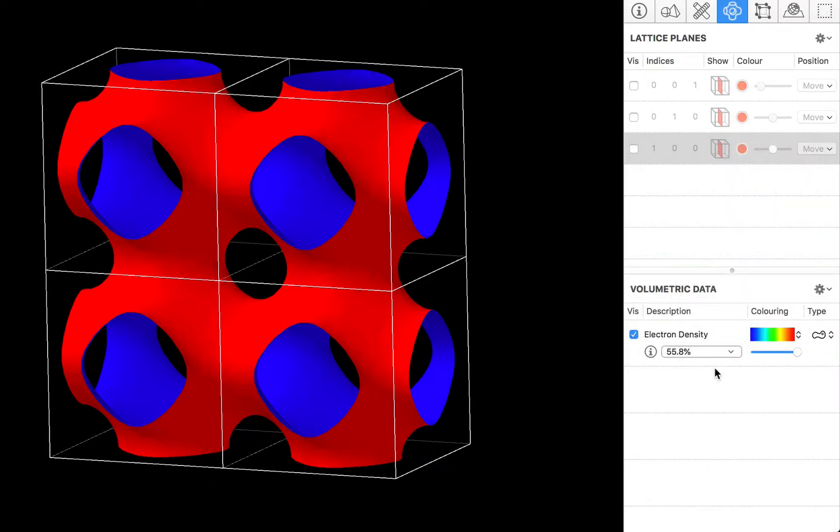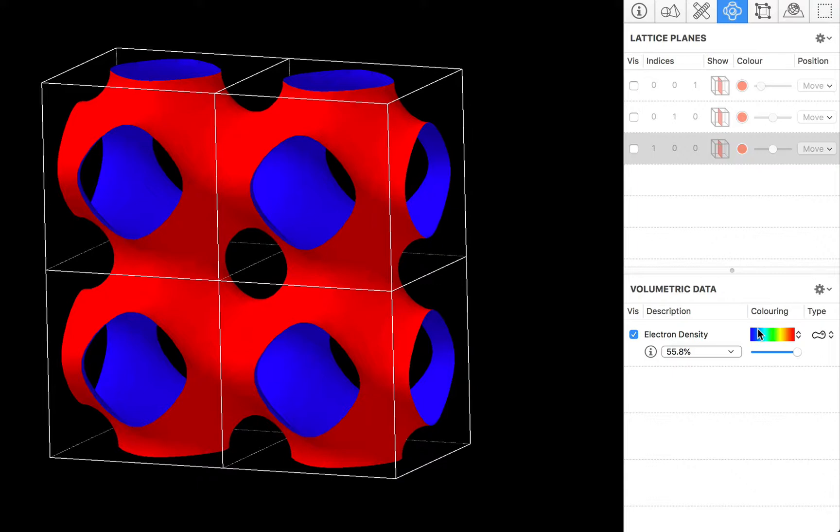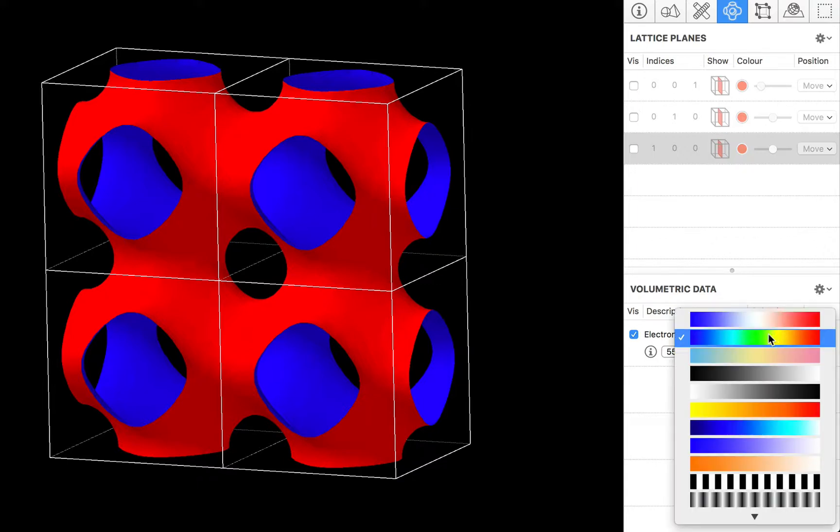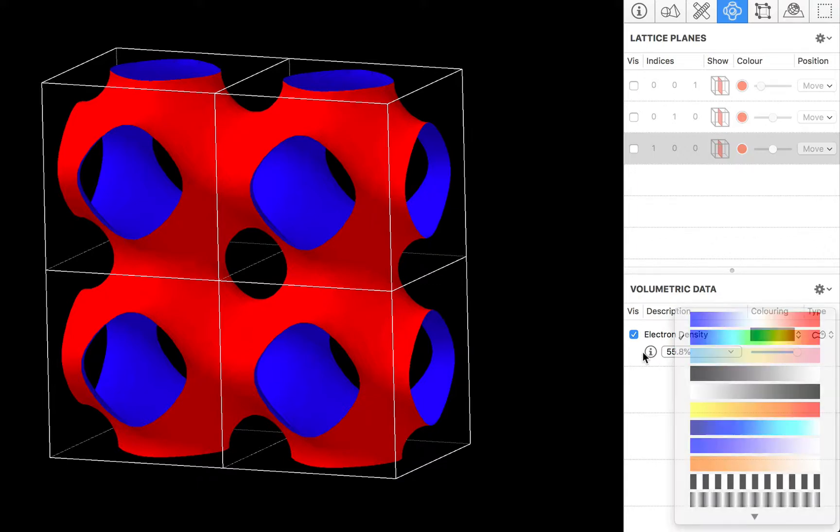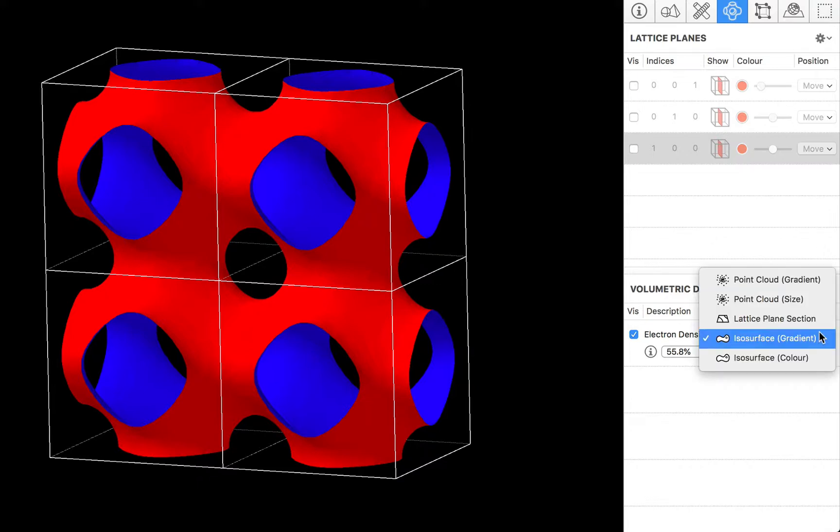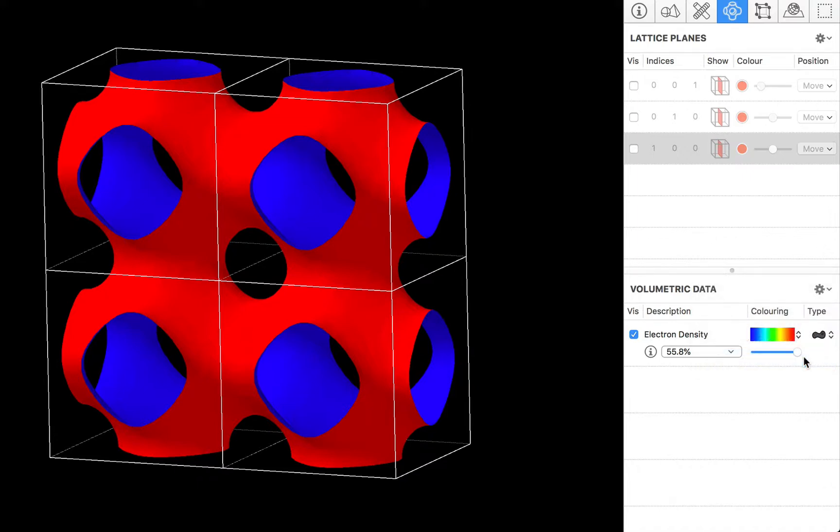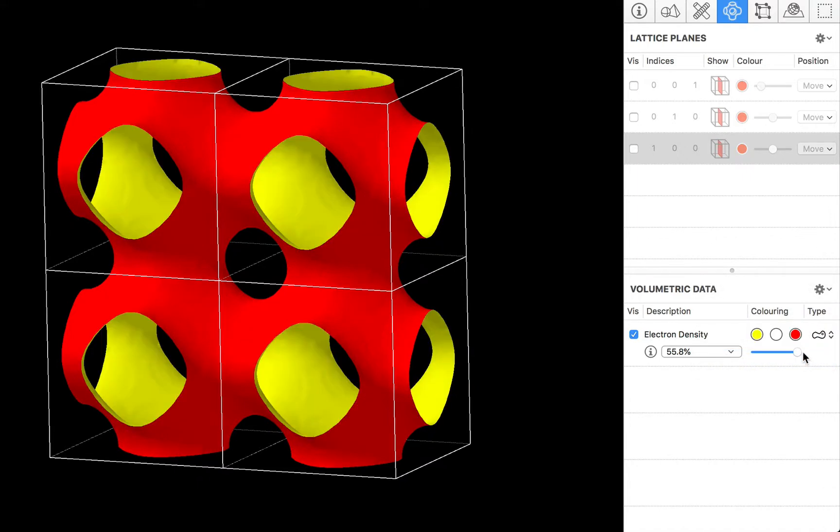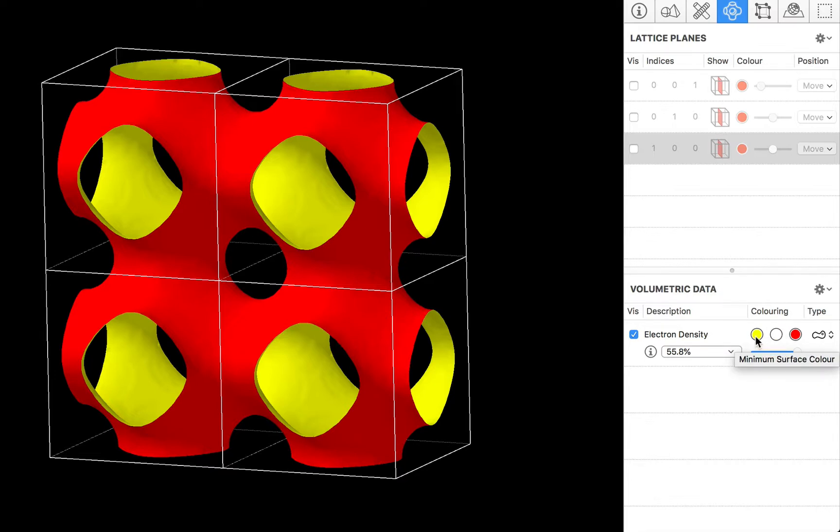So here our ISO surface was plotted using this gradient option which you can change. You have another option for ISO surfaces which is to use fixed colours. So instead of a gradient display we have colours for the maximum data point, the minimum data point and any kind of truncation of the data volume. So let's have a look at how this works.